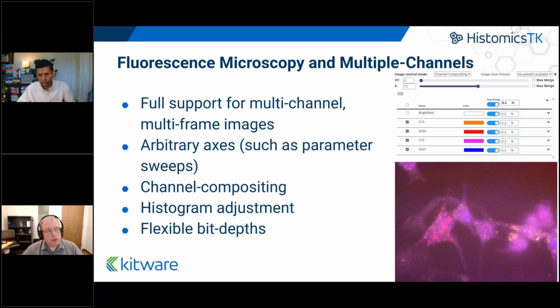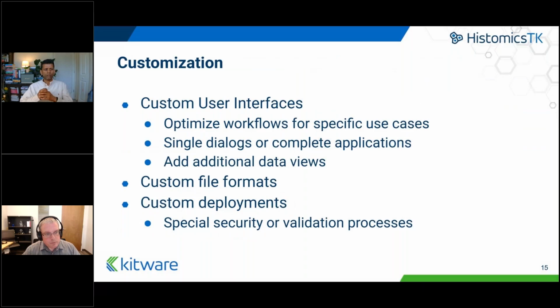So if you run a data analysis in your software and say, let me try varying this parameter and see what sort of results I get, you can do that parameter sweep and output the results into a file and then look at it very conveniently, scrubbing through it like we were seeing, to find the actual best values to use, for example positive pixel count for detecting neurofibrillary tangles in brain tissues. You can do that very efficiently with this, rather than trying to look at each individual image by yourself. It's much easier to have a scrubber.